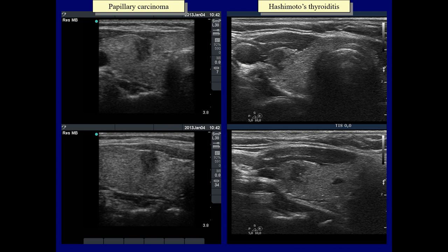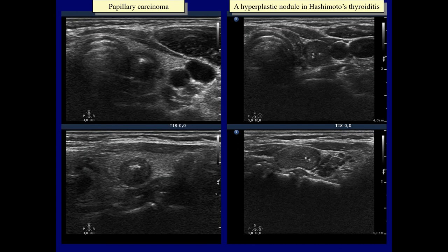On the other hand, it is worth comparing the borders of the nodules. The papillary carcinoma displays blurred while the thyroiditis displays sharp, puzzle-like borders. The sonographic presentation and the likelihood of malignancy is similar in these nodules; both present a cluster of microcalcifications.